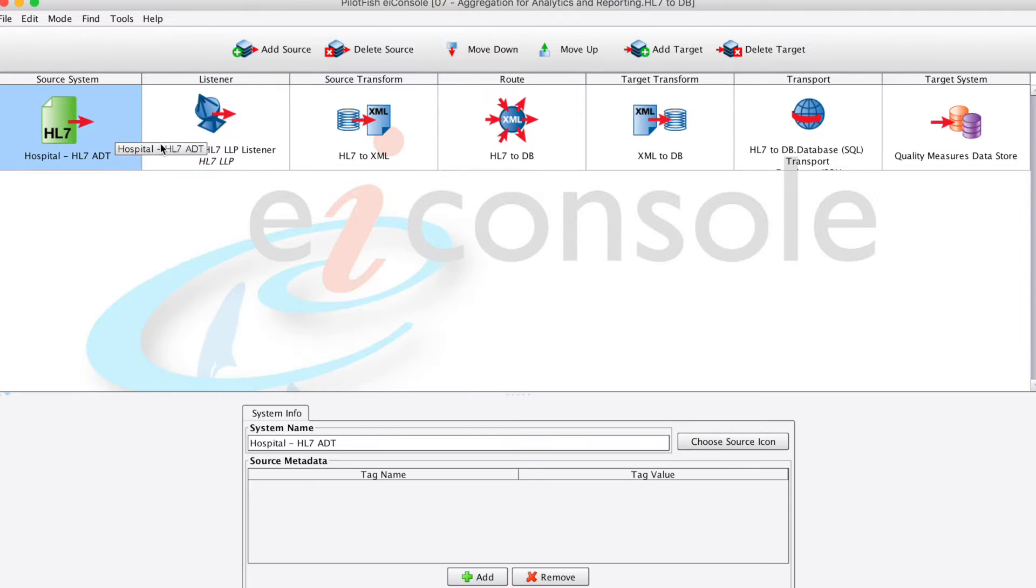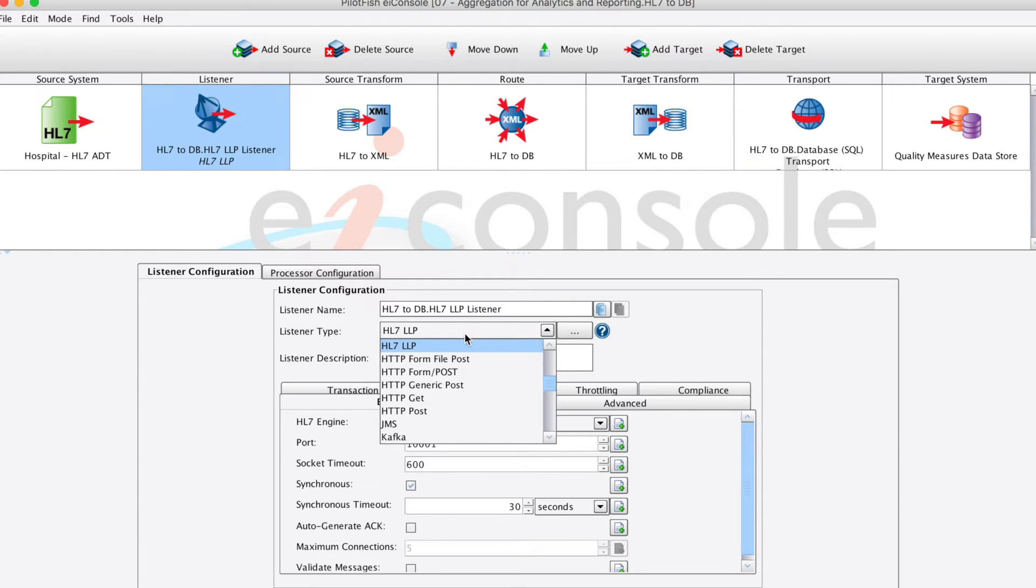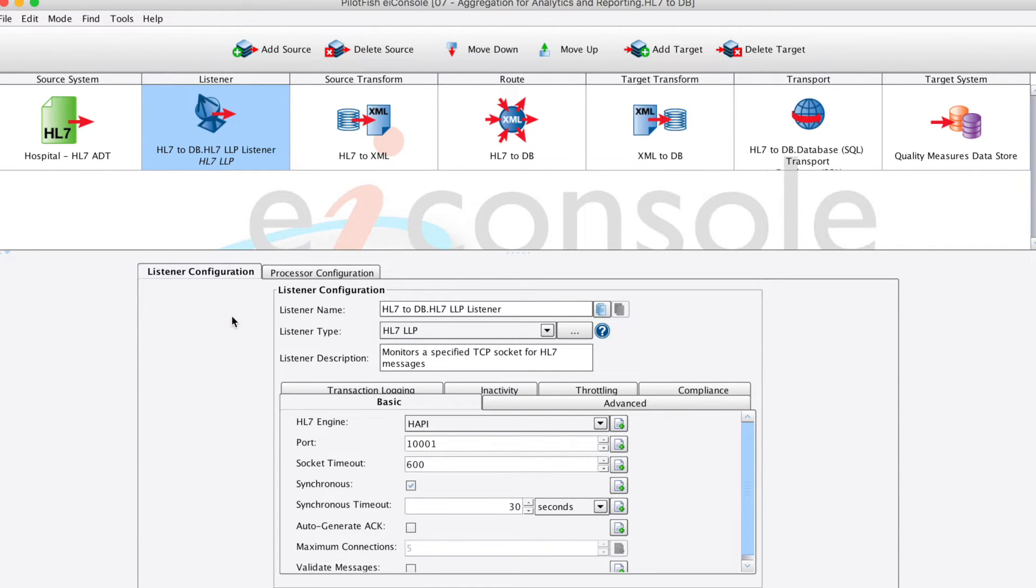We'll begin with our listener. In this case, we're using HL7 over LLP. This listener monitors the specified TCP socket for HL7 messages.